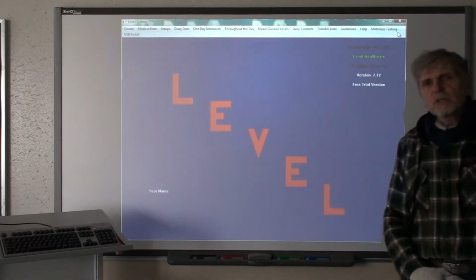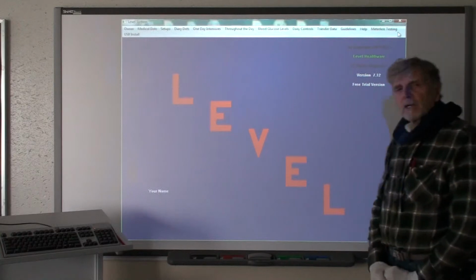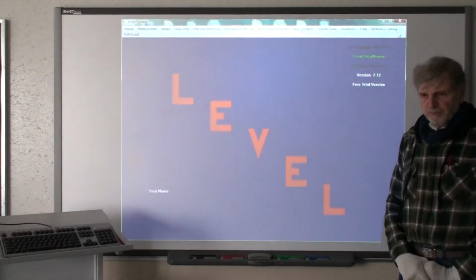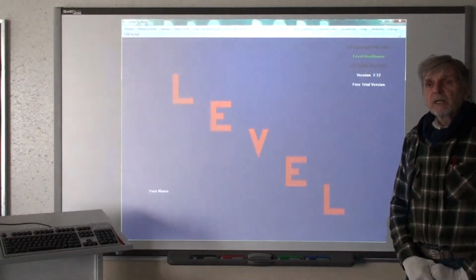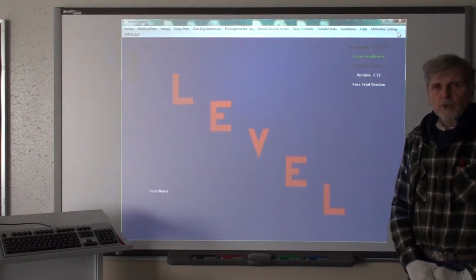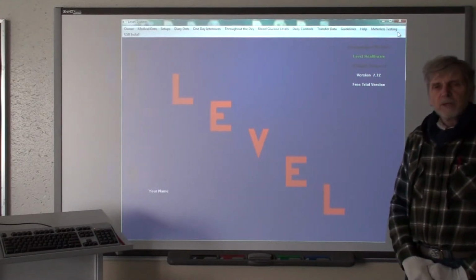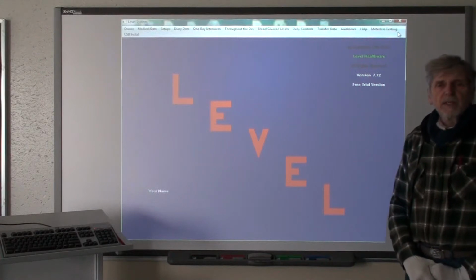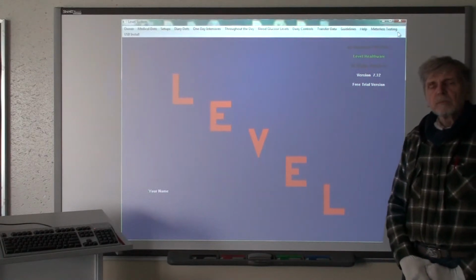Now, let's address the question of where on the internet that location is going to be. It's going to be in a location of your own choosing and your own control. All that is needed is that you acquire a location on an FTP server.